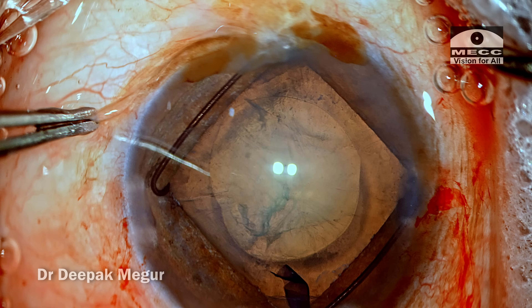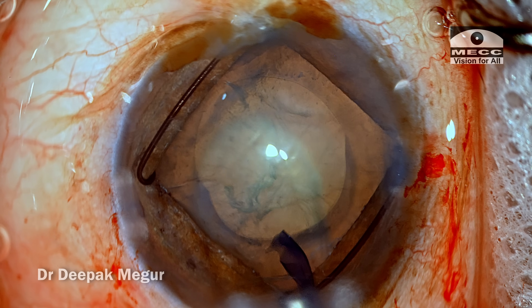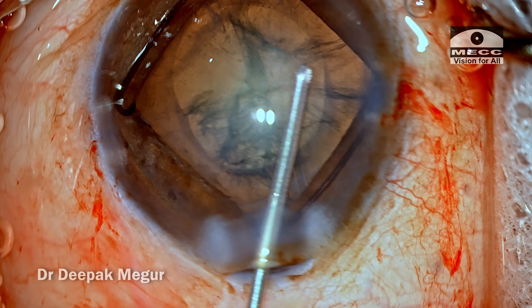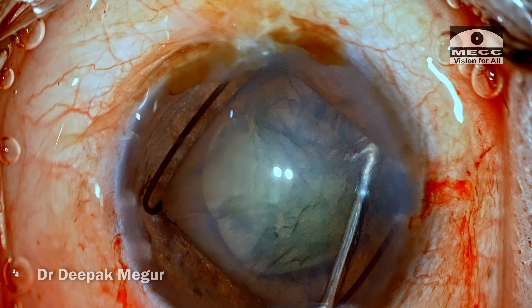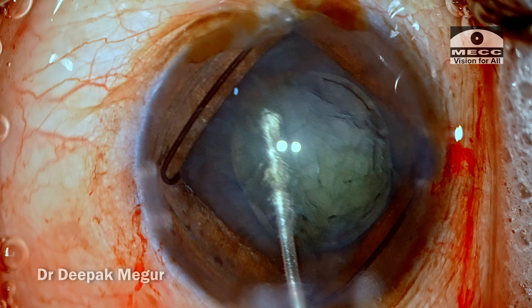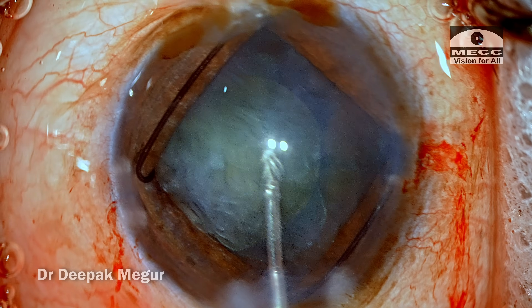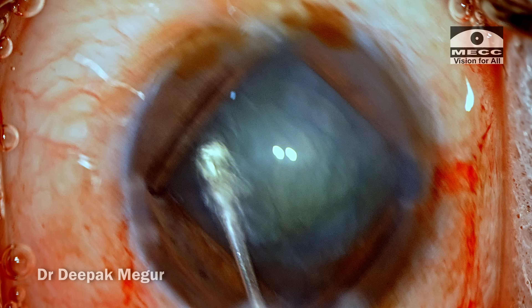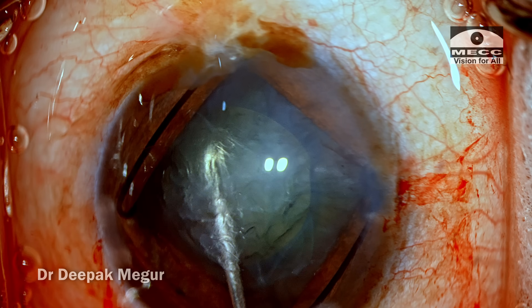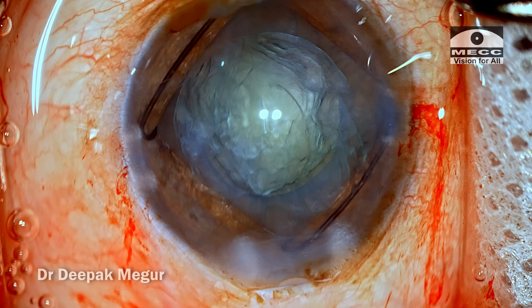The next most critical step is to get a good hydrodissection — this is absolutely critical. I would not proceed with nucleus management until the corticocapsular adhesions are broken down so that any nucleus maneuvering does not impart stress on the zonules. As I'm doing hydrodissection and trying to decompress the bag, one can literally see that the entire bag is also moving as I try to nudge the nucleus around. This suggests hydrodissection might not be totally successful, which is always a possibility when dealing with eyes with zonule laxity, simply because we don't have the counter-traction of the zonules to aid free movement of fluid across the lens.